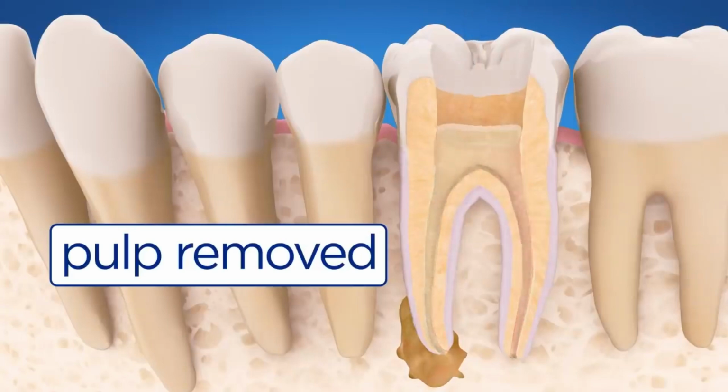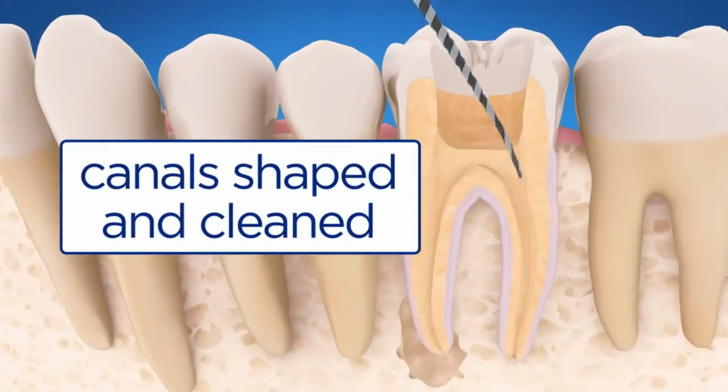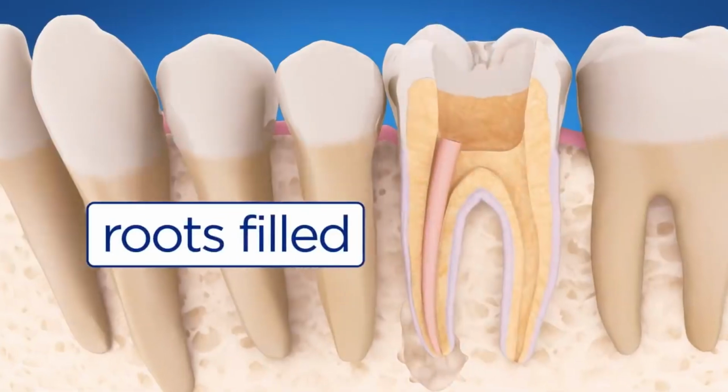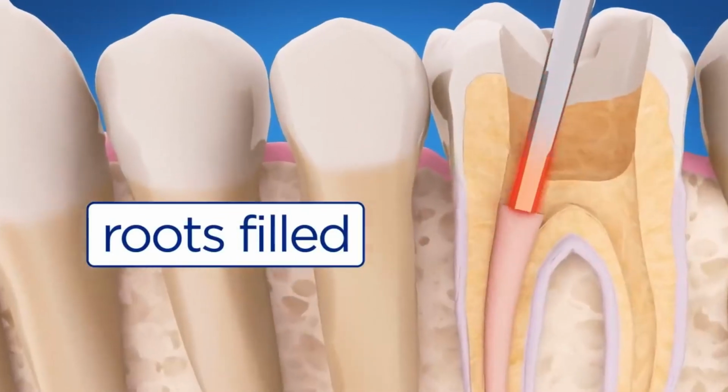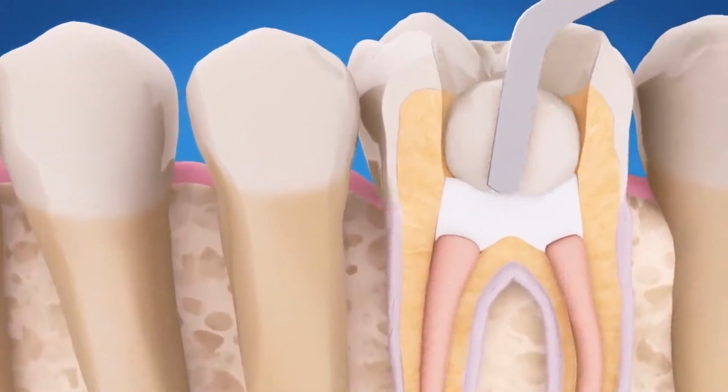Using small instruments, the endodontist carefully cleans and shapes the canals. After the space is cleaned and shaped, the endodontist fills and seals the root canals. In most cases, a temporary filling is placed to close the opening.